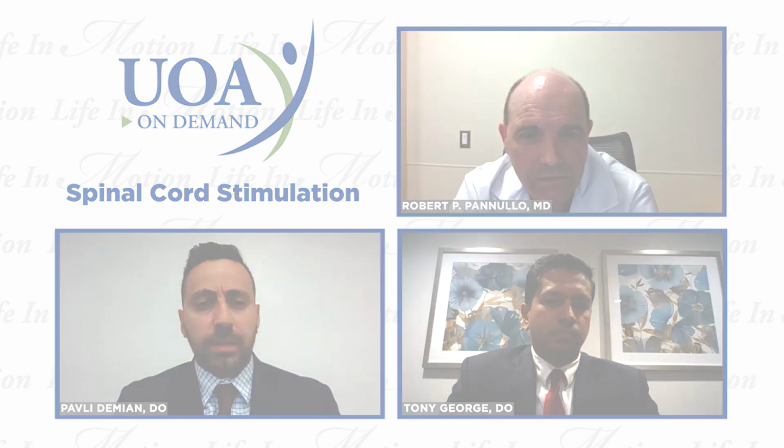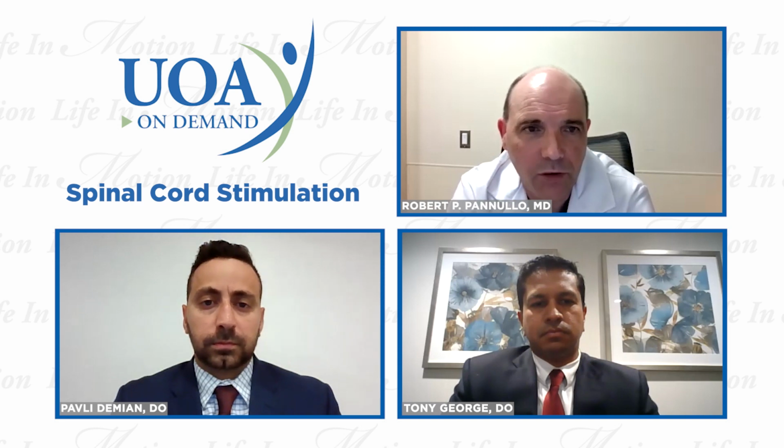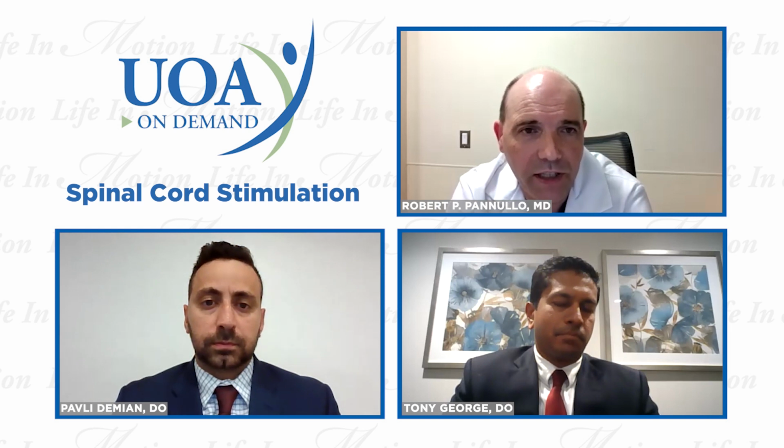Dr. Pannullo, how would you explain the process and the system of spinal cord stimulation to your patients who may be concerned about having this implant in their body? Well, one relatable analogy would be that it's like a pacemaker for the back. A pacemaker has wiring that is put into the heart, and the battery is then placed into the chest wall. Here, this is the wiring that goes into the back, and the battery is placed in either the lower lumbar region or in the upper buttock.